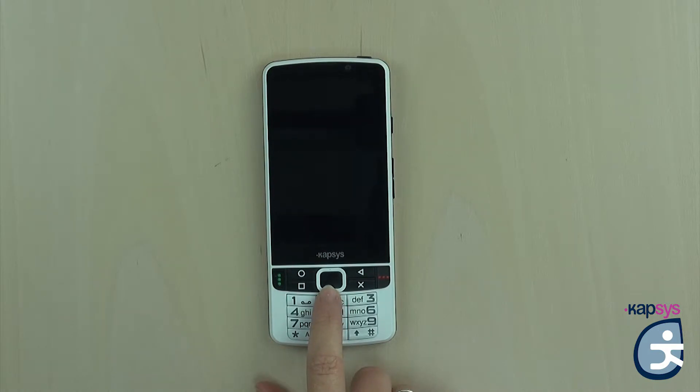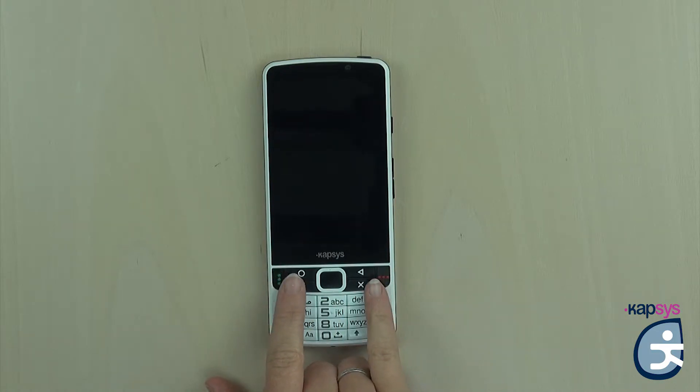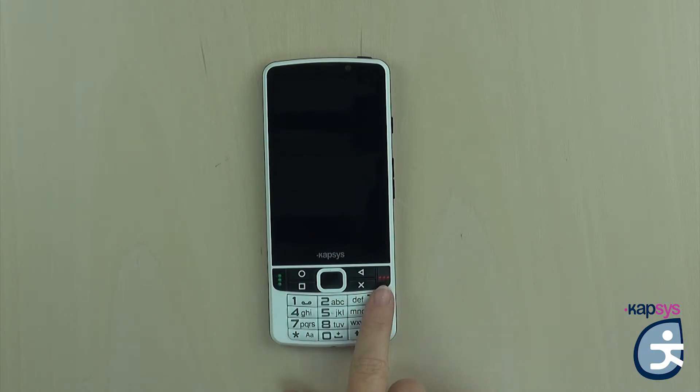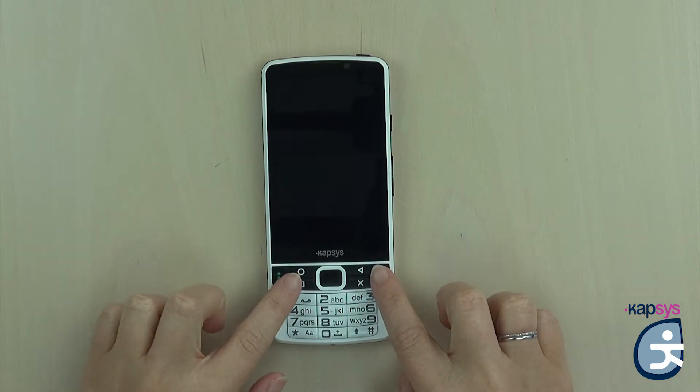At the left and right sides of the navigation pad, you have dedicated keys to pick up and hang up calls. The pick-up key is located at the far left and has three small green vertical embossed dots. The hang-up or release key is at the far right and has three small red horizontal embossed dots. Both keys are very easy to identify with your fingers.